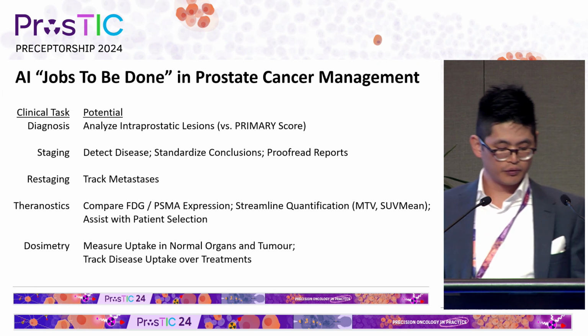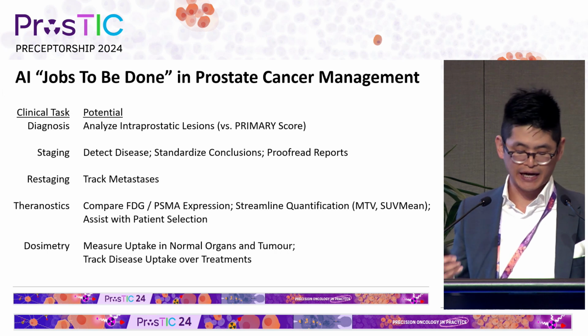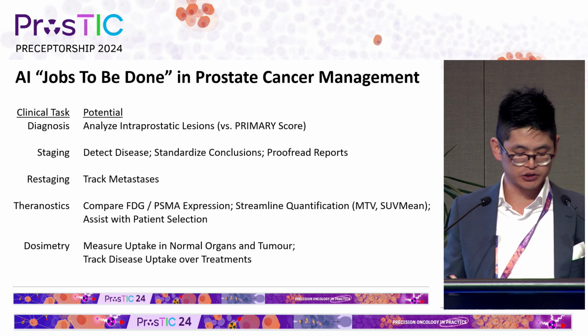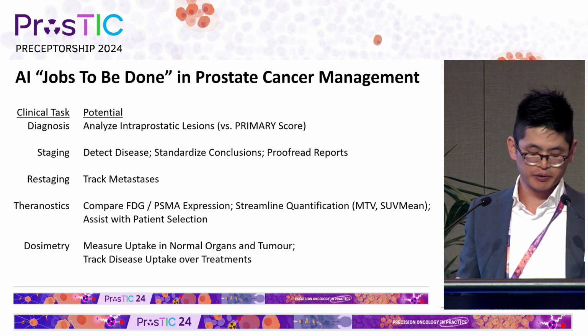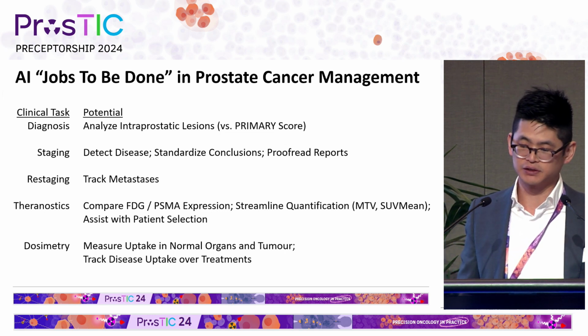Moving forward, we need to move beyond these technical steps and focus on actually the clinical task and subtasks applied to the specific prostate cancer patient journey. And we need to standardize these clinical tasks and subtasks because this will help us construct the sorts of trials we need to gather appropriate evidence.